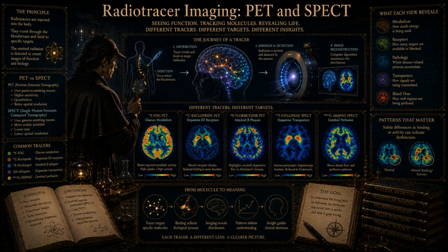So how do you fix it? Because you have to know exactly how much tissue the photon traveled through to correct for it. This is where the physical properties of PET provide an almost miraculously elegant mathematical solution.